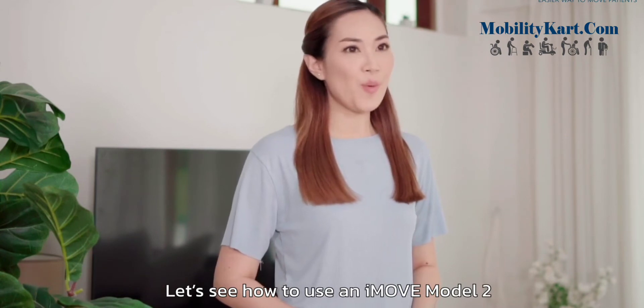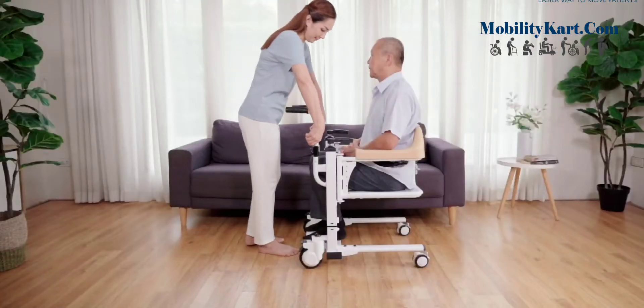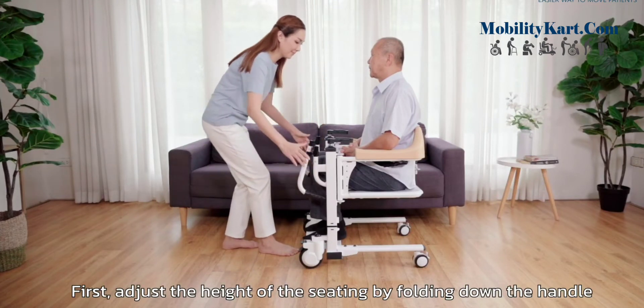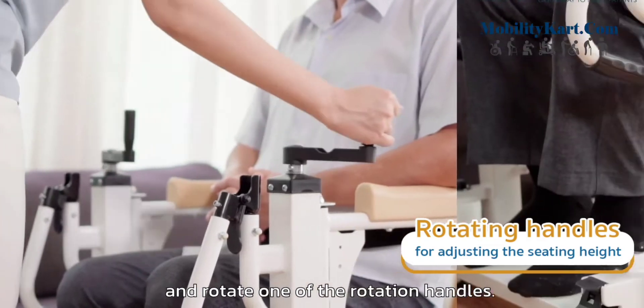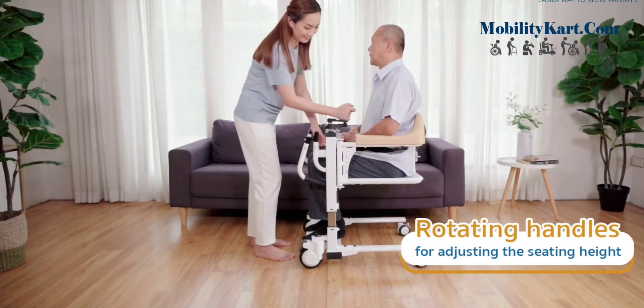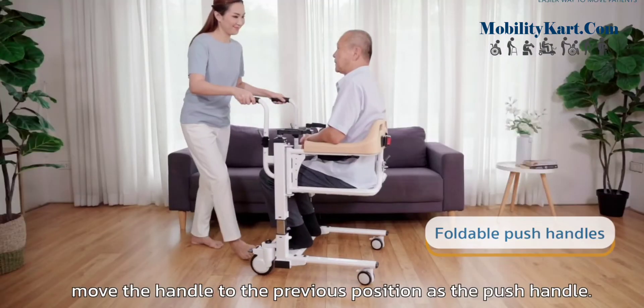Let's see how to use an iMove Model 2 patient transport wheelchair. First, adjust the height of the seating by folding down the handle and rotate one of the rotation handles. Finished! Move the handle back to the previous position as the push handle.